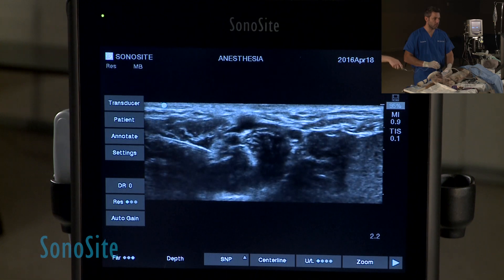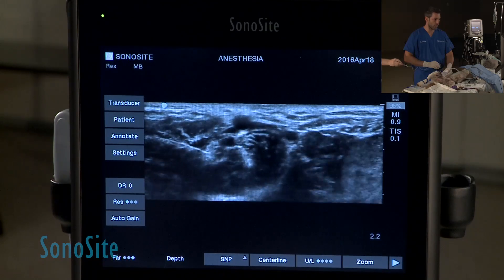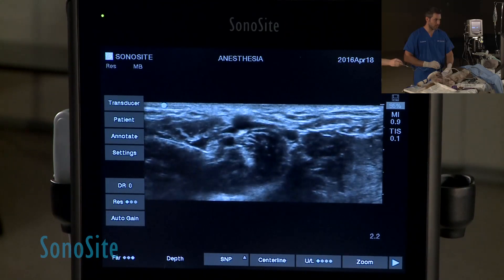Okay, so right now we are in the nerve. We localized, we turn off the stimulator so we stop moving, but I have already the needle right by the nerve.